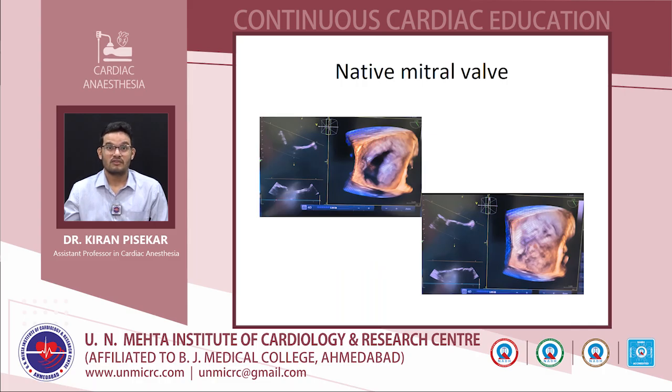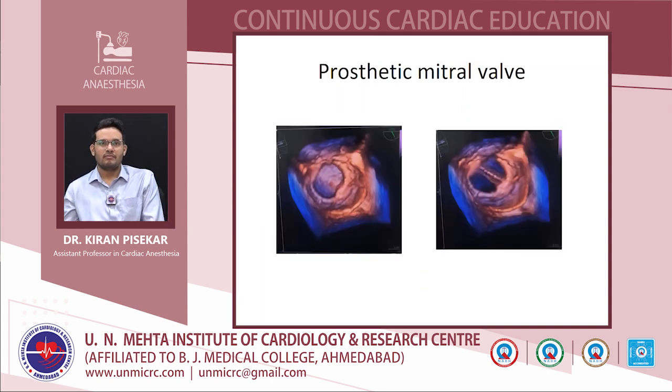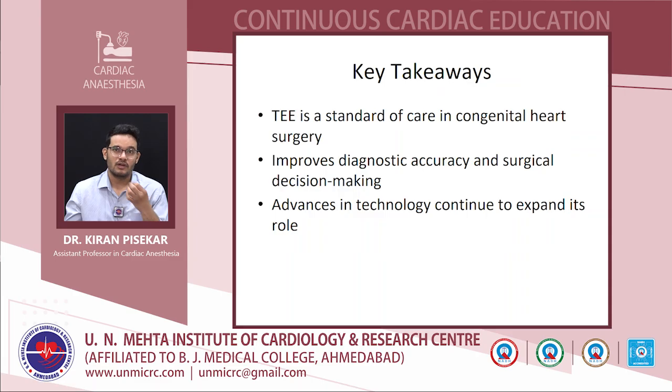Now this is a 3D image of the native valve. This is a mitral valve, which is open. This is a closed mitral valve. So this is the AML, this is the PML. Now this is a prosthetic mitral valve in closed and open position. So it helps in assessing the leaflet mobility. If you put the color Doppler here, then it helps in assessing the paravalvular leak as well.